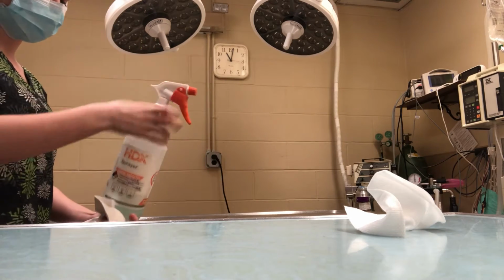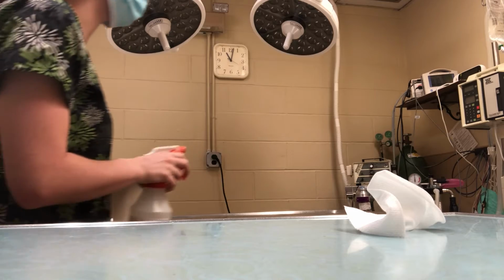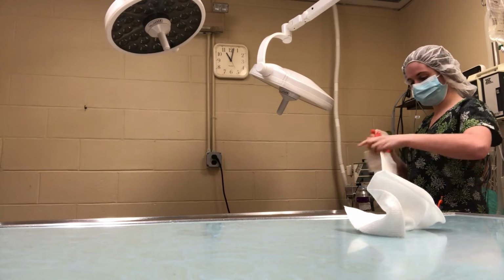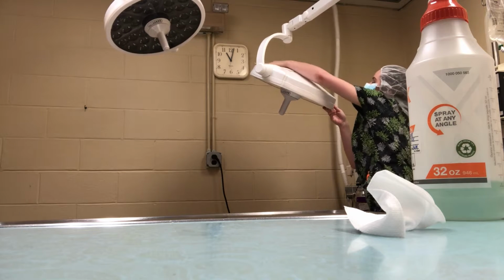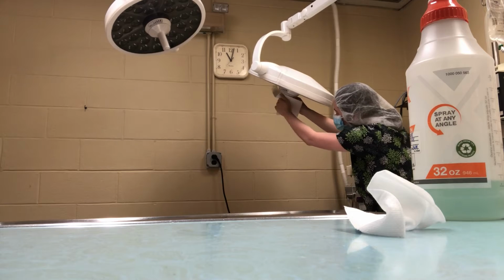So this is for our chlorhexidine solution, so I'm going to give that some contact time. In the meantime, I'm also going to clean our lights. The outside, basically anywhere that collects dust. We also want to get the handle too.